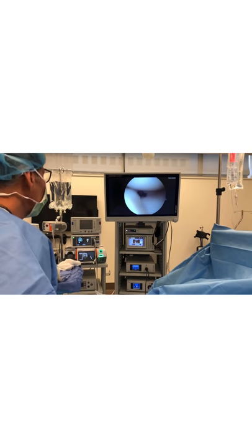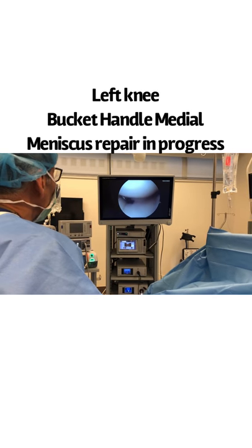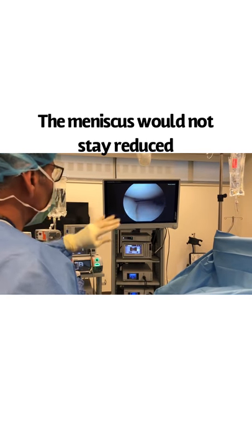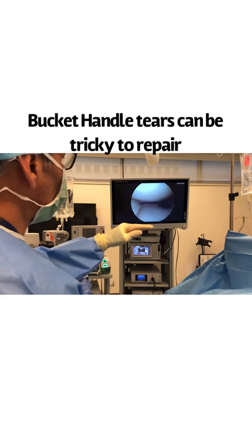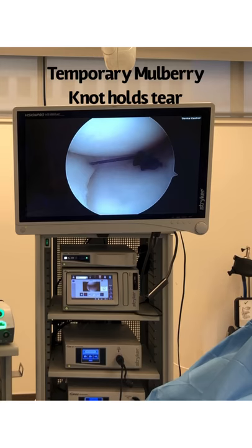So I tied a mulberry knot. A mulberry knot is something that I do when I'm having problems keeping the meniscus back in place because it's a bucket handle — it goes back and forth like a bucket handle — and I was having a little trouble with this bucket handle going back and forth.